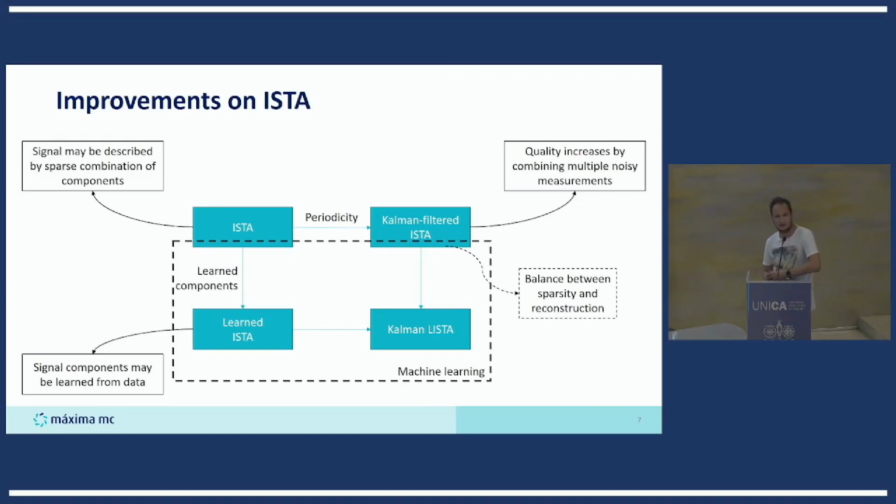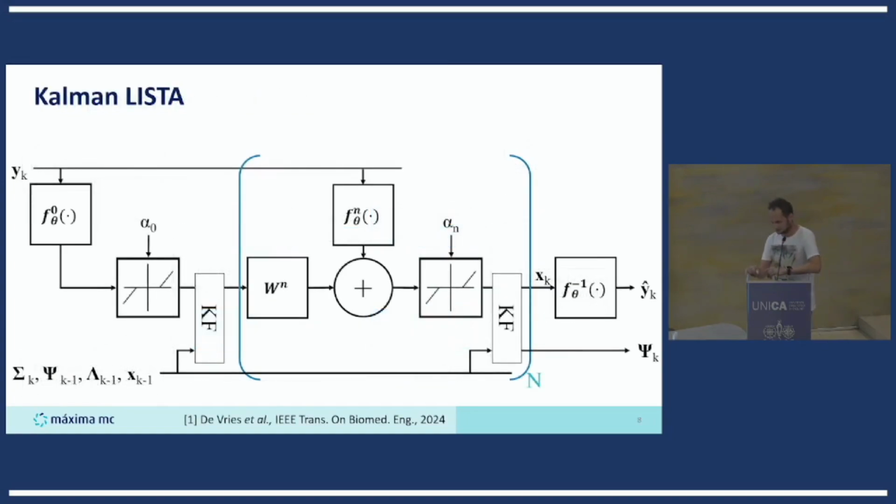We can train it unsupervised, because the target in our training is actually going to be the next heartbeat, which is extremely noisy. But if you keep repeating that, it will at some point start to learn that that noise doesn't repeat, and those blocks do repeat and do appear. So you can train it unsupervised.